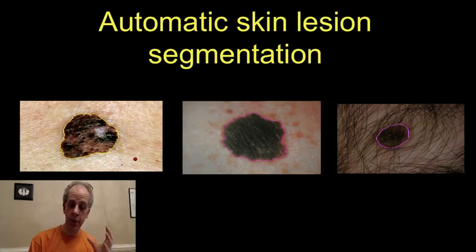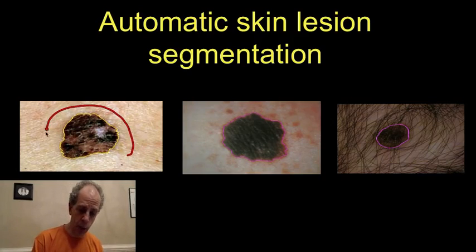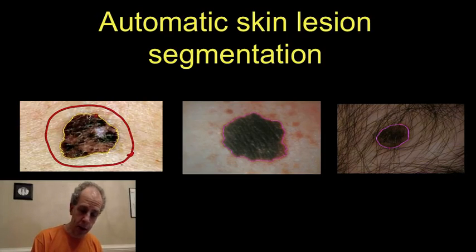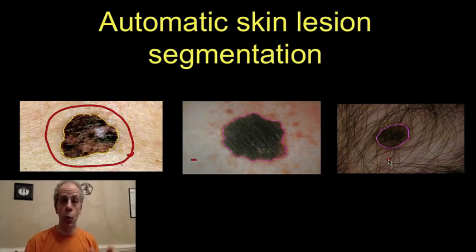But the problem is very specific. So you think and you say, I have learned how to do image segmentation. One of those techniques is active contours. So you can start with a contour and you can let that curve deform towards the boundary of the object, this yellow curve, and all these three images were actually segmented out with active contours.